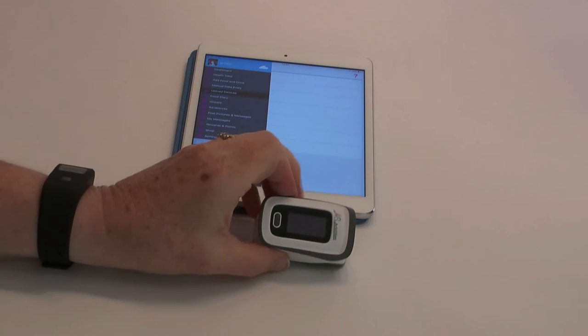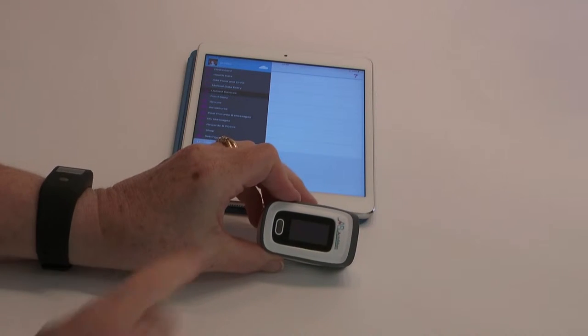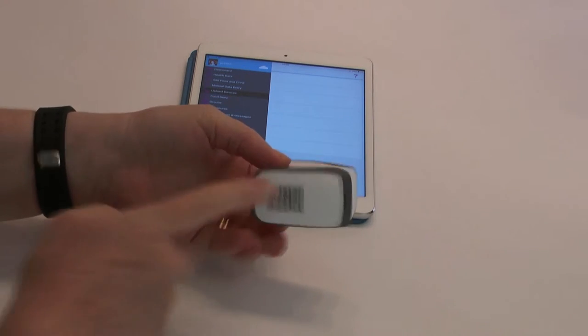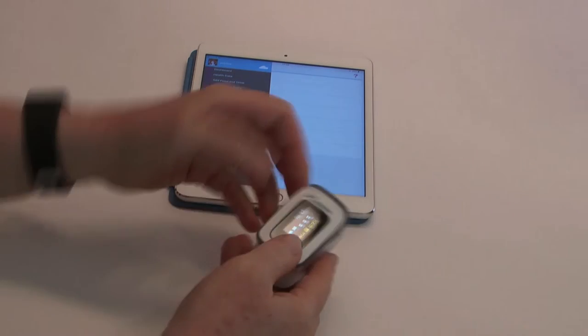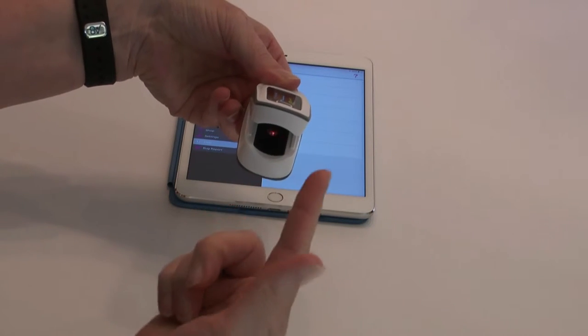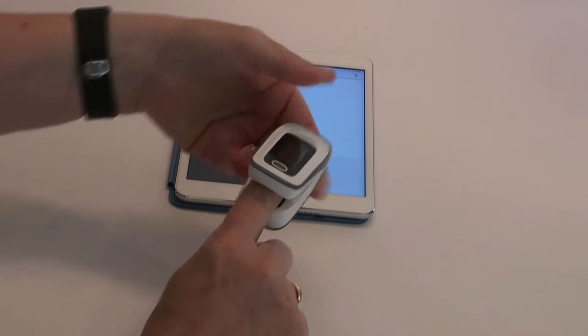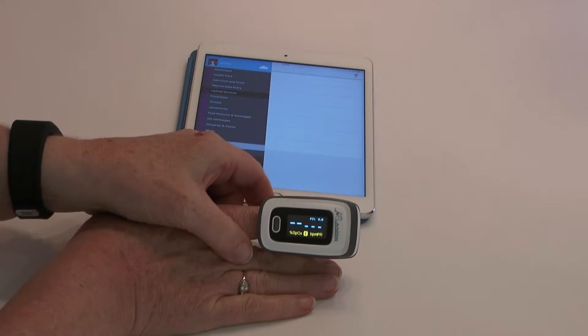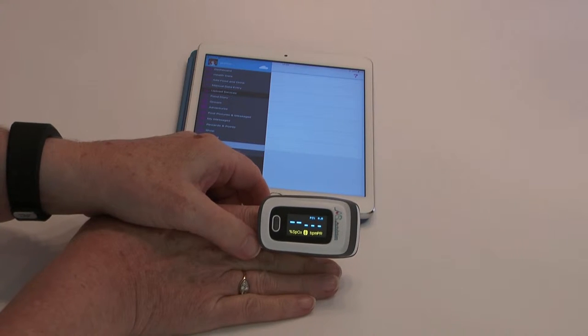The pulse oximeter 2 can be turned on by a single button on the front, which is reverse of the battery compartment at the back. The finger clamp is adjustable for small or large circumference fingers, and you should push your finger right through to the end of the cuff, placing your fleshy part of the finger over the light.